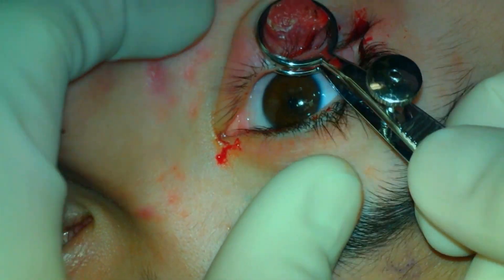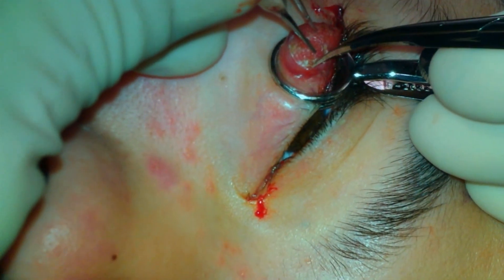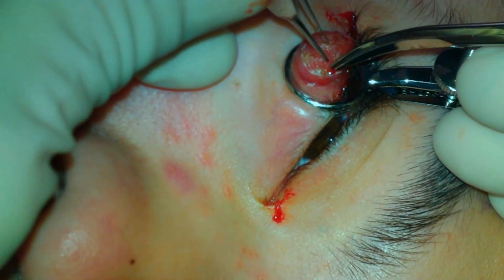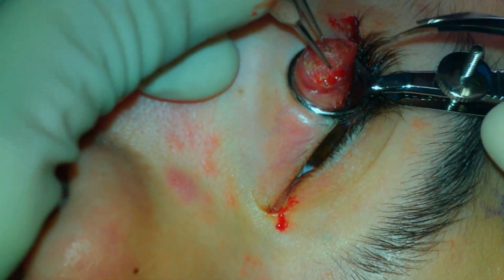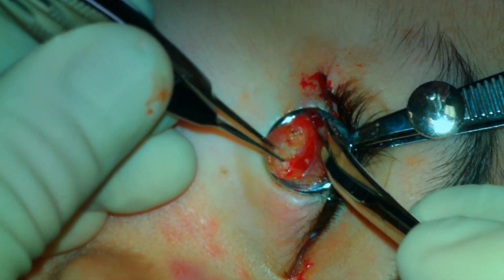A chalazion clamp is placed on the eyelid. In this situation, the skin overlying the chalazion is extremely thin and will not be able to be salvaged. Westcott scissors are then used to make an incision at the junction of the salvageable skin and the very thin skin around the lesion.